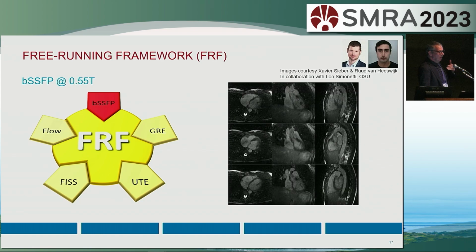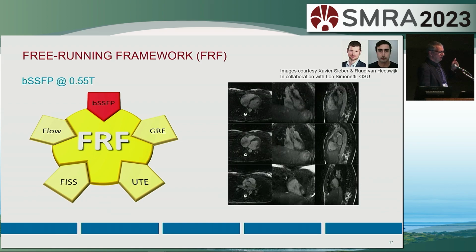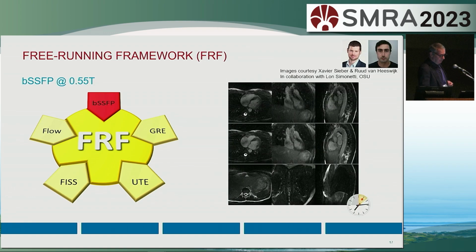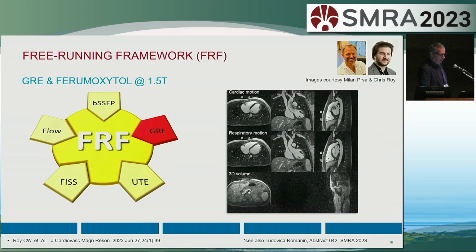No sophisticated denoising is applied yet, but nevertheless, on this system, without EKG, without bellows, without navigators, these images came out right away. So this is very promising, and the acquisition duration was only about 6 minutes. So there is still a lot of leeway, still a lot of opportunity to improve.